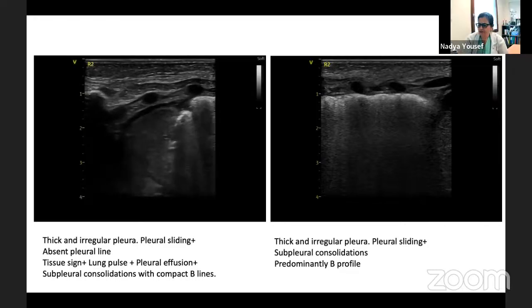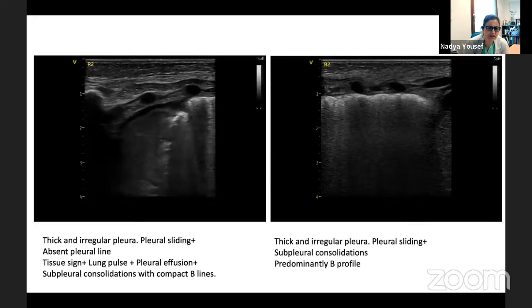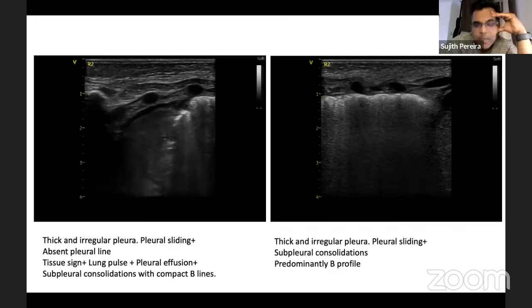Very strange. In chronic lung disease, you do have changes like this, but you're positioning the baby, suctioning the baby, ventilating the baby, changing management strategies. So these change. When you flip the baby over, it opens up in one side and closes in the other. The exact same place is really suspicious, though. So this was not related to the possible pneumonia. This was something this baby had before, during. Yes, that is right.